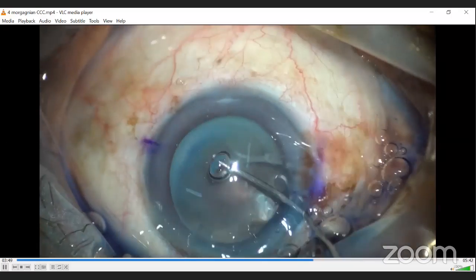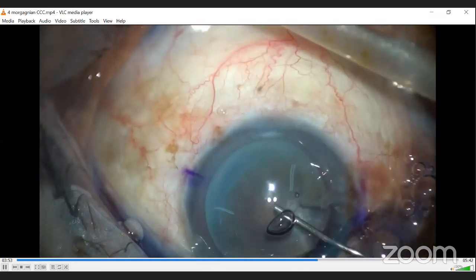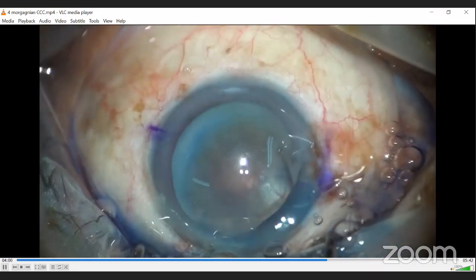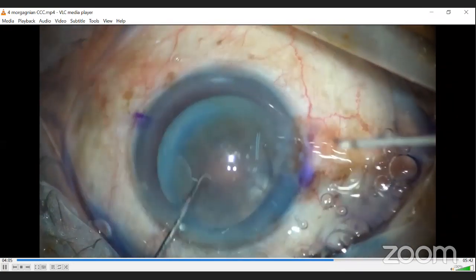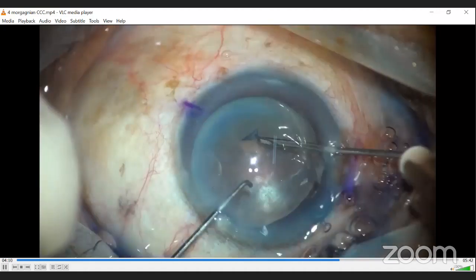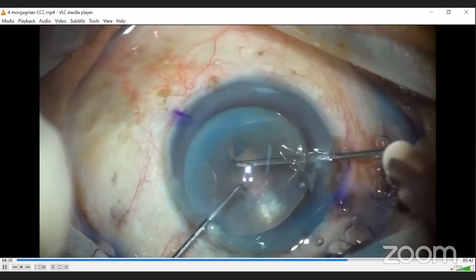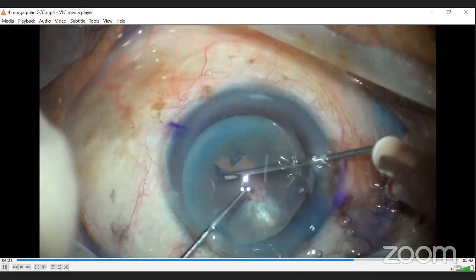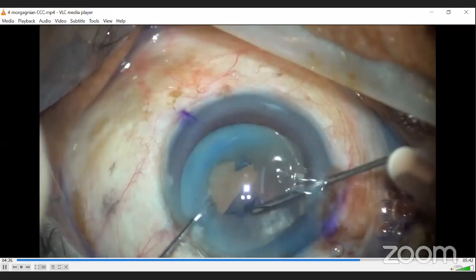In Morgagnian cataracts, I always use a good OVD like Viscoat so that the pressure is maintained over the anterior capsule and the flap remains down. Now see, I am trying to use cystitome here. Now watch what happens. So here I could raise the flap. I could push the flap back a bit. So I have flattened the flap now. I'm going ahead with the capsulorhexis.